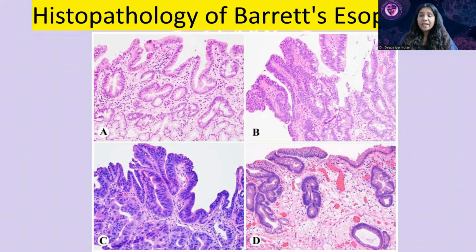Indefinite for dysplasia is a diagnostic category which should not be used just like that. You have to use this diagnostic category when the epithelial changes are raising a concern for dysplasia, but are not giving you a confirmation of a definitive diagnosis. Don't use it as a waste paper basket because it will directly impact the surveillance of the patient.